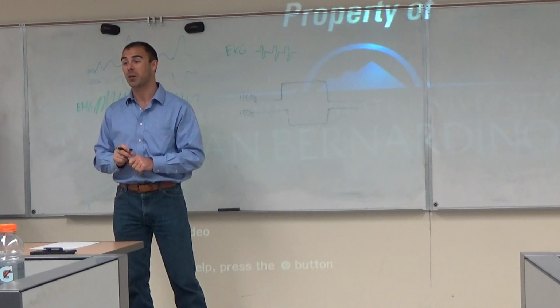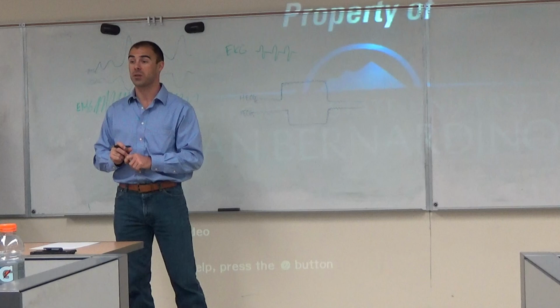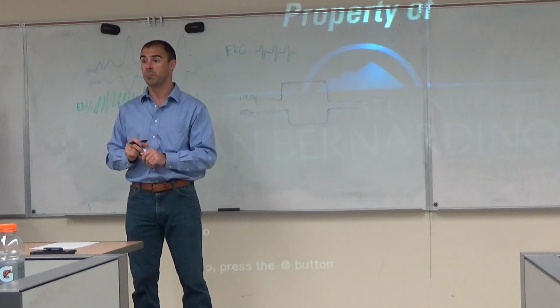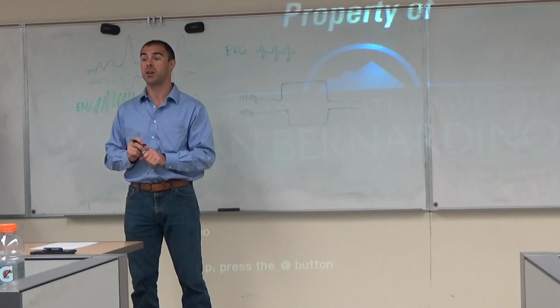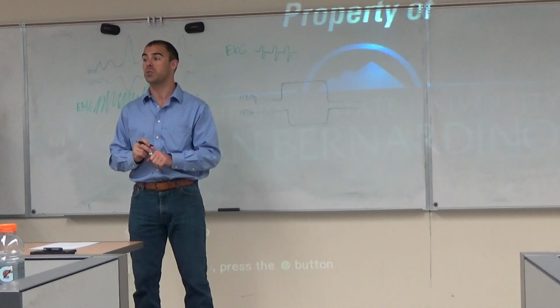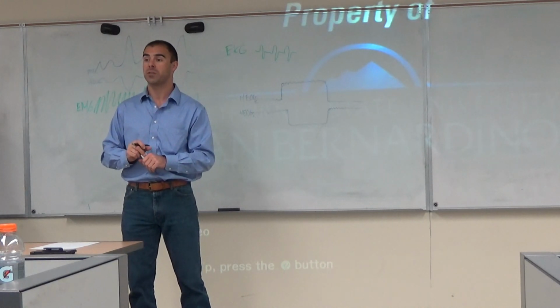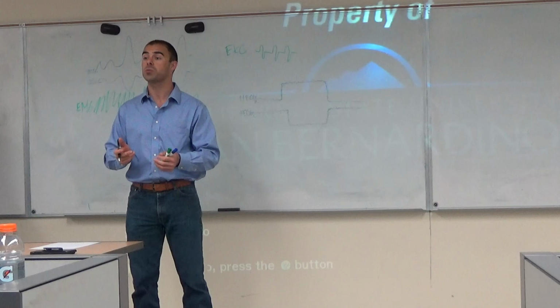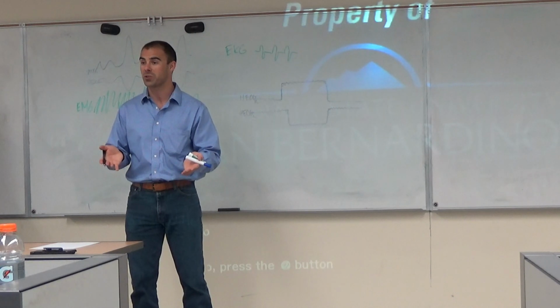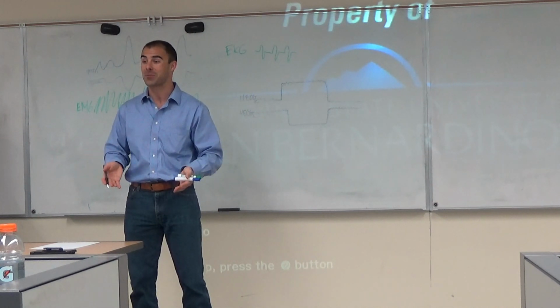Other times you might actually have hypotheses about alpha. Particularly, let's say that you study attention. Maybe you want to study ADHD in people. Alpha turns out to be a frequency of activity that is very closely related and correlated with states of attention. And so in that case, you wouldn't call it an artifact. That's actually your variable of interest.